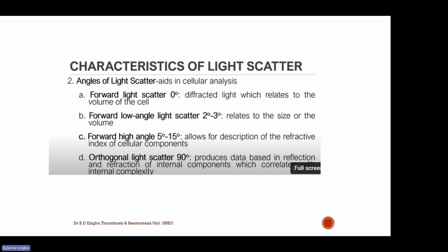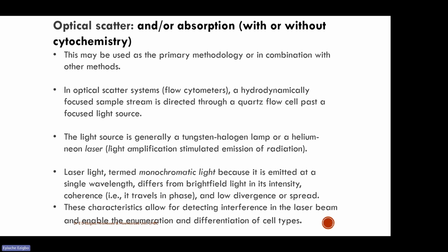Optical scatter and/or absorption with or without cytochemistry. I think this is exactly what I've been explaining earlier. I'm talking about the light source and the properties of light. Is there anything new here now?